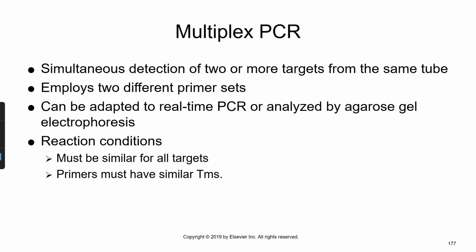Multiplexed PCR. So multiplex PCR is a new and emerging, really cool idea. This doesn't have clinical applications yet per se, but it will in the very near future. What they can do is take a swab from a patient's nose, a nasal swab, or a respiratory swab. They could swab their throat, and then they can do a multiplexed PCR on it to identify any possible microorganism that could be causing the infection. So we have a list. Let's say these are the top 10 most likely respiratory pathogens.